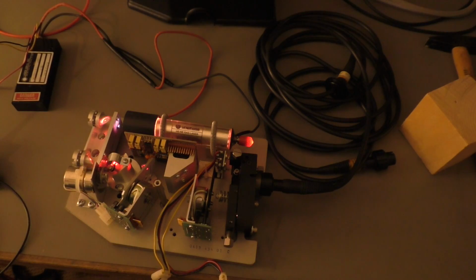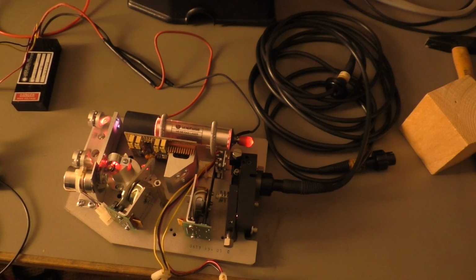Okay, that's a nice shot. Okay, I think it works that way.